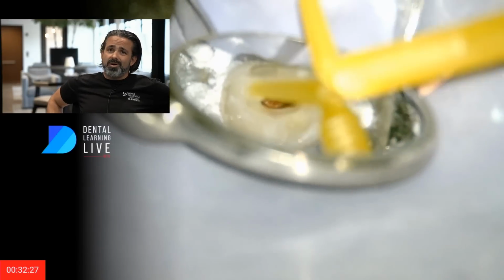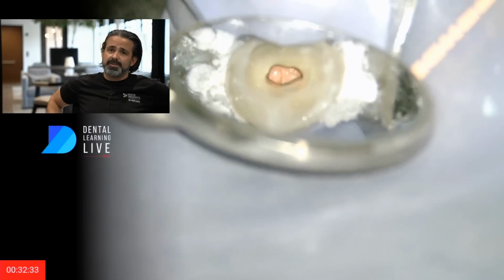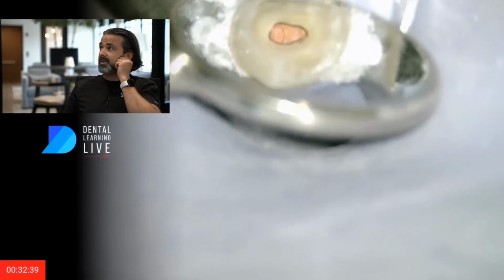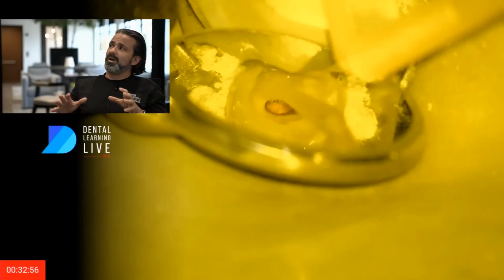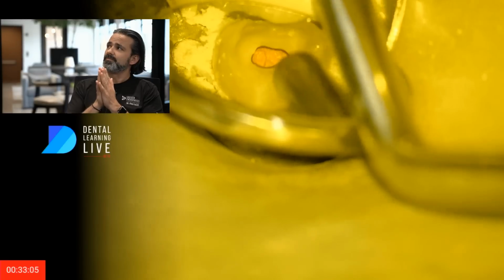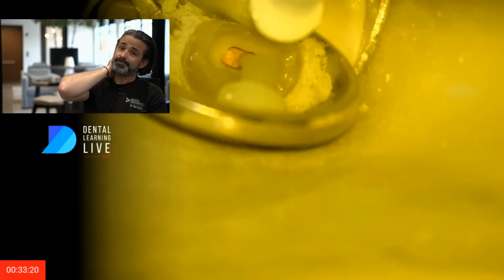So I went back to alcohol right after I was done with the obturation technique, and just kind of drying it up, blow it dry, and then I use a conditioning agent and then the bonding agent. It's a two-step, and then cure the bond. And I do that for lots of reasons, because I want to make sure there isn't any schmutz inside that tooth, and that I'm really adapting the bond layer to the dentin and parts of the enamel really well. And so I don't want any moisture in that. So alcohol is just something that I do, and then blow it dry, conditioner, blow it dry, place the bond, and really try to scrub it, and then light cure it.